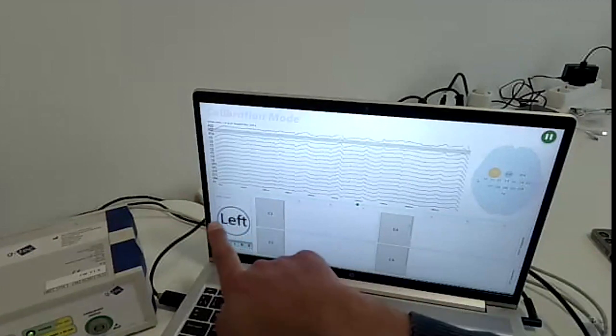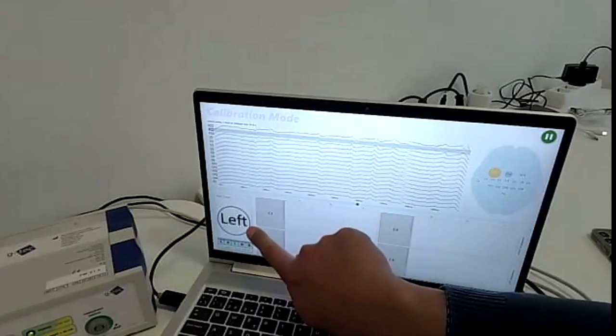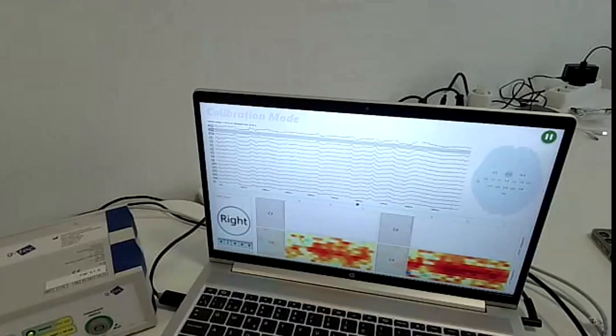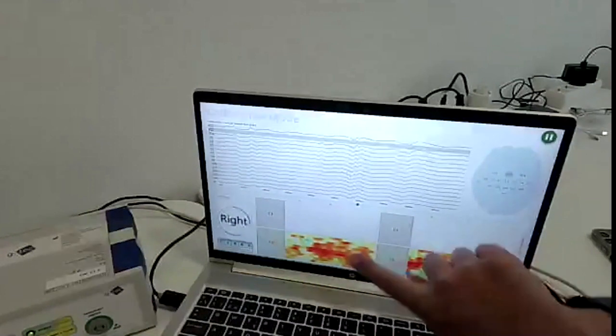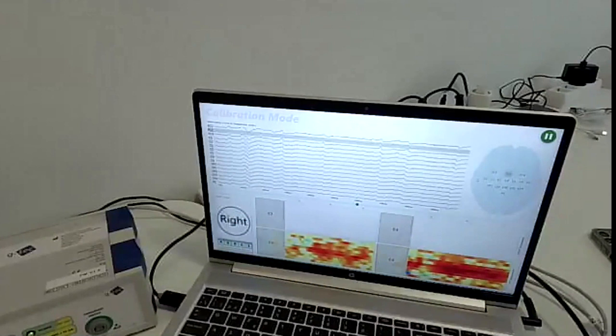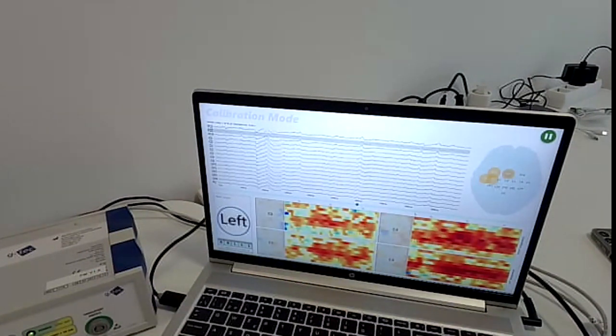On this side of the screen, you see the next order coming. For example, now it's left. Now the right order is coming. And we can see the first ERD plots. We have enough data now to calculate the ERD plots. Mark, Ari is asking what the program announcement is actually saying, because we can hear it but it's in Spanish. In Spanish, it's left or right. Derecha means right, and izquierda means left. So we skip the pause period. We can see here the ERD and ERS plots.